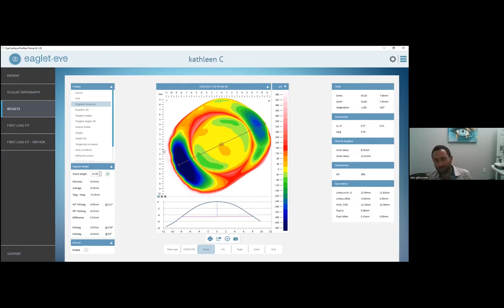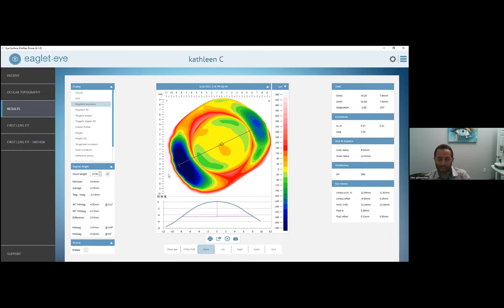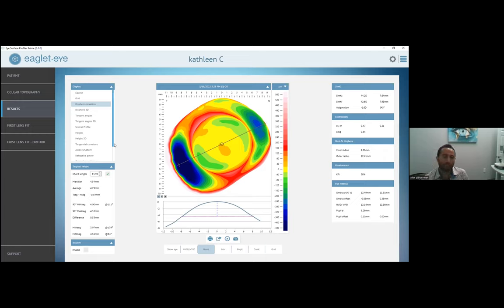That data is really for your information so you know what's going on with the eye. Just looking at the map, I already have a good idea of what it'll look like when I put a trial lens on. If we look at those big blue areas where the eye is significantly lower and we put a spherical lens on, those edges are probably going to look pretty flat. The temptation is to think: now we have these magnificent scans and all this data, why not just submit it to the lab? Why even put a scleral on the patient? And I think the answer is no.